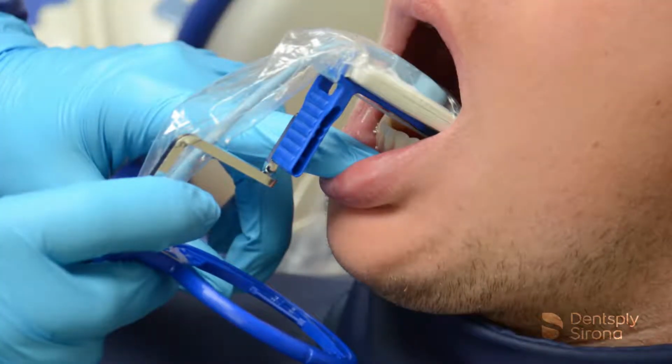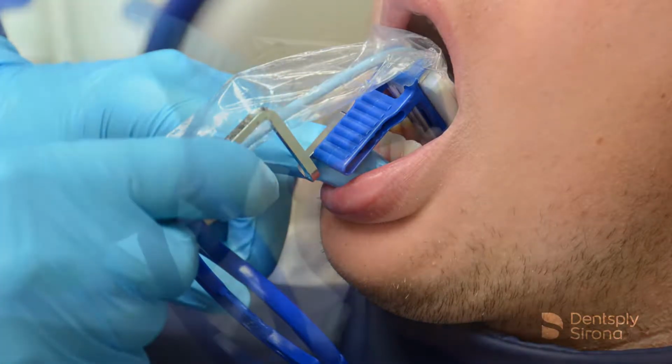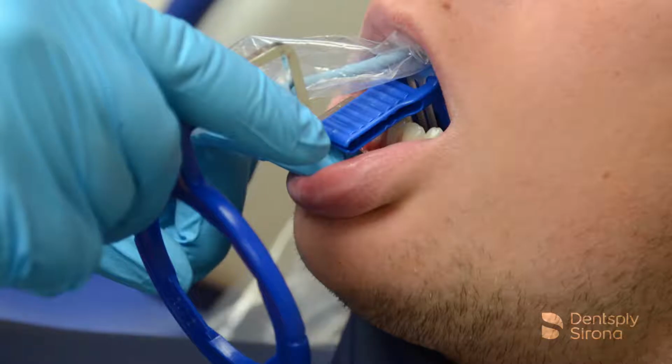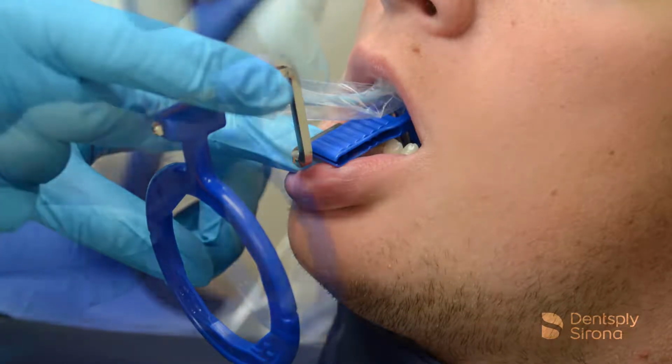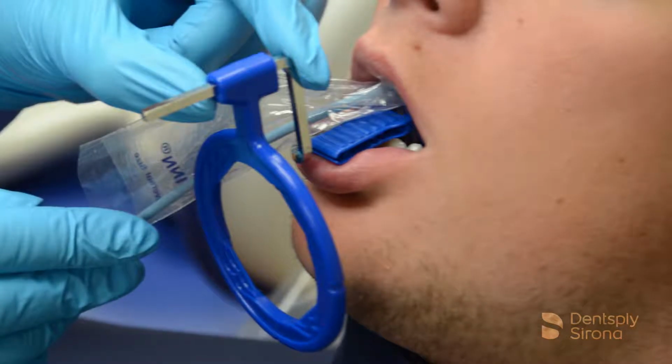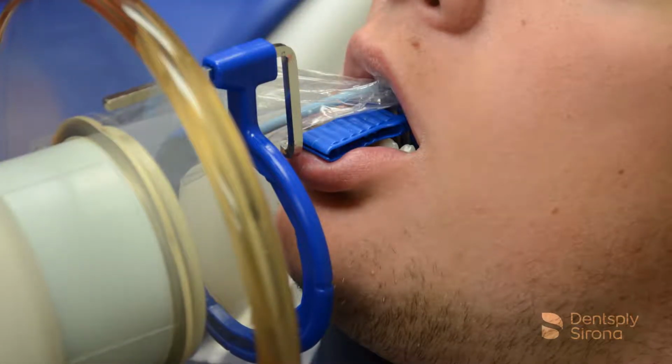Continue capturing images of the mandibular anteriors by positioning the image receptor in the same manner used for the maxillary anteriors. Center it behind the teeth being captured, instruct the patient to close slowly, and align the handheld portable X-ray device. The image is now ready to be captured.